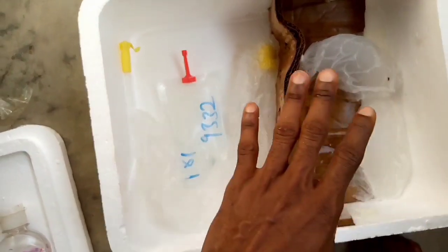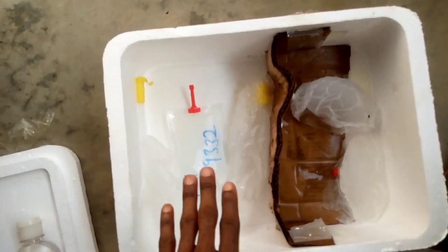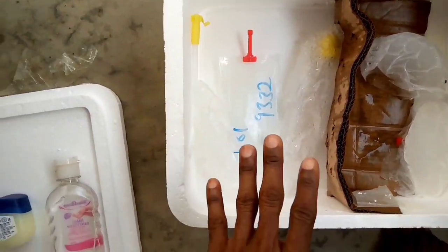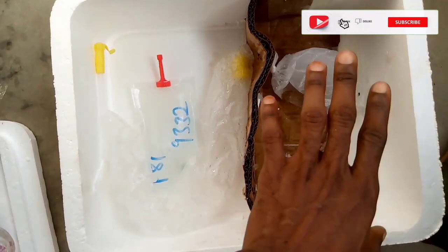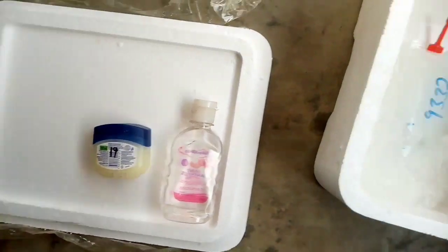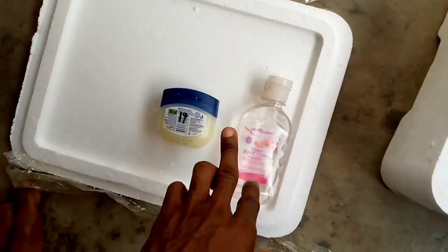We ordered the semen and it came in this container which was maintained at a temperature between 16 to 19 degrees Celsius. The first thing I'm going to do is replace these ice blocks with new ones so that it stays under the same temperature before we begin our artificial insemination. The most important things we are going to use are the catheter, the semen, the sanitizer, and the lubricant.